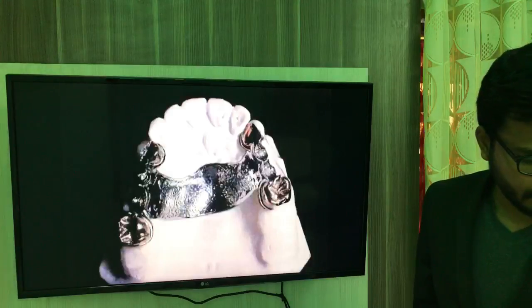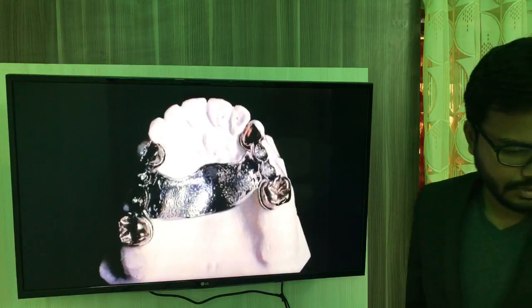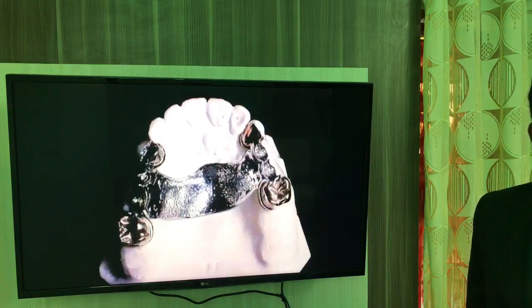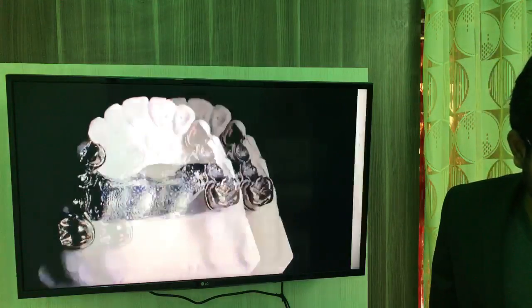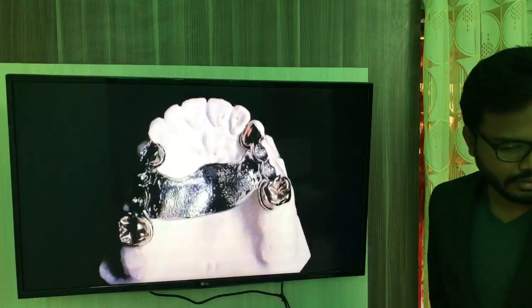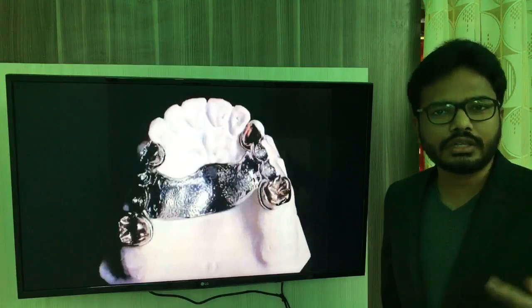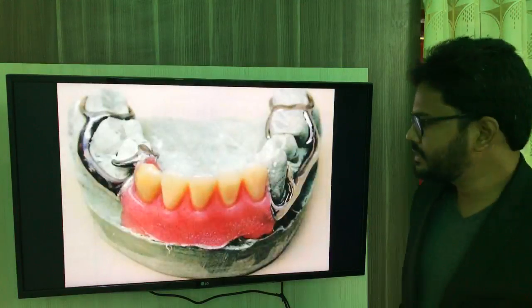And what does this image represent? Yes, Abhishek. So this is your normal palatal strap. I think we've seen that previously. Okay. So this is your palatal strap, right? Anyways, don't worry. At the end, I will just try to summarize all this once again for another 5-10 minutes. Okay. Right. So what does this major connector represent?